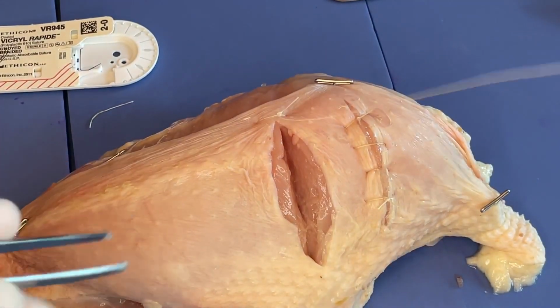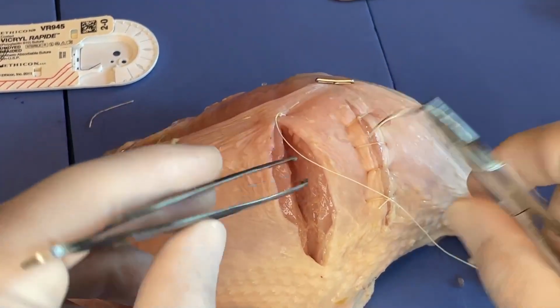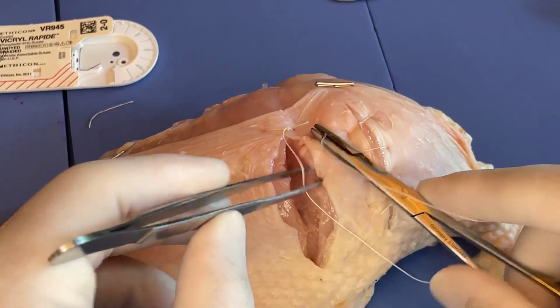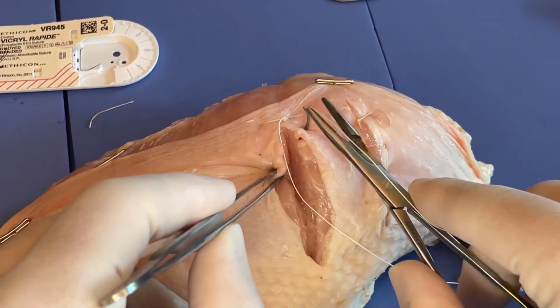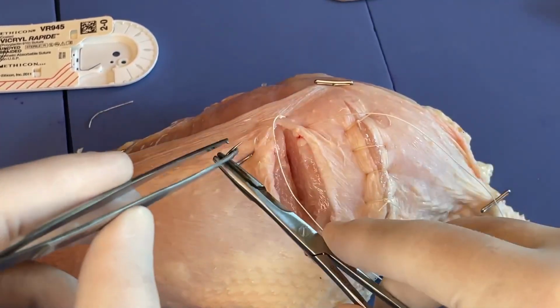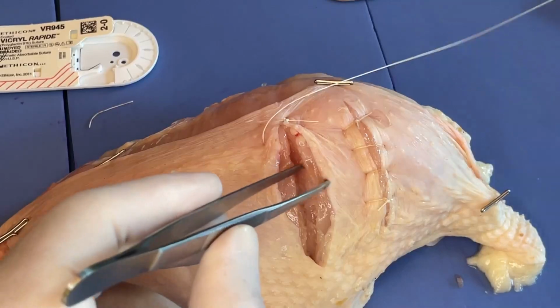All right, so instead of cutting both sutures, which we would do if we were doing just an interrupted, we just cut the short suture, the part with the needle attached we've obviously left attached. And so now we're just going to come down and do side to side. And again, here we're doing it in kind of one pass, reloading the needle at the tissue, pulling that through.